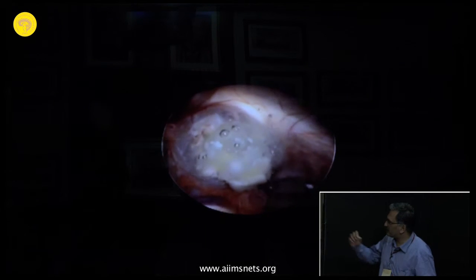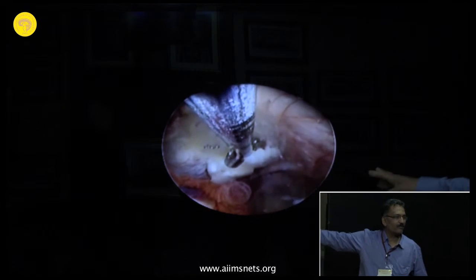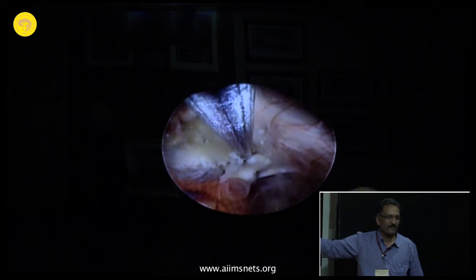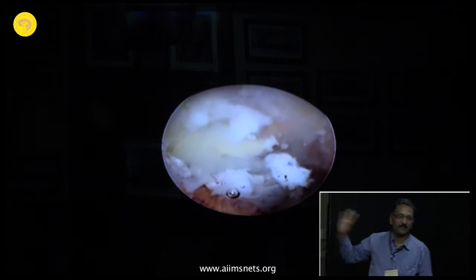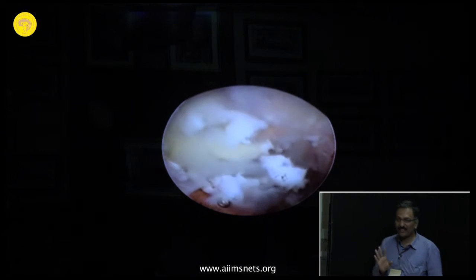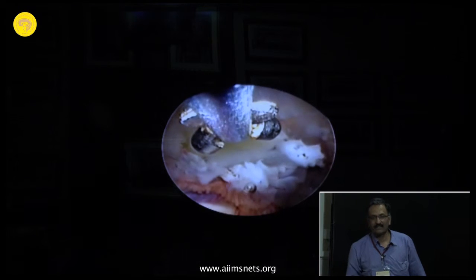And with this thick secretion, you just keep on doing it. This is not a 2 minute job, it's an edited video, otherwise it's a 20 minute thing. You're just removing, and it's not getting removed, right? So this is also one situation where you can get into some kind of trouble, and you really need to look at this situation.